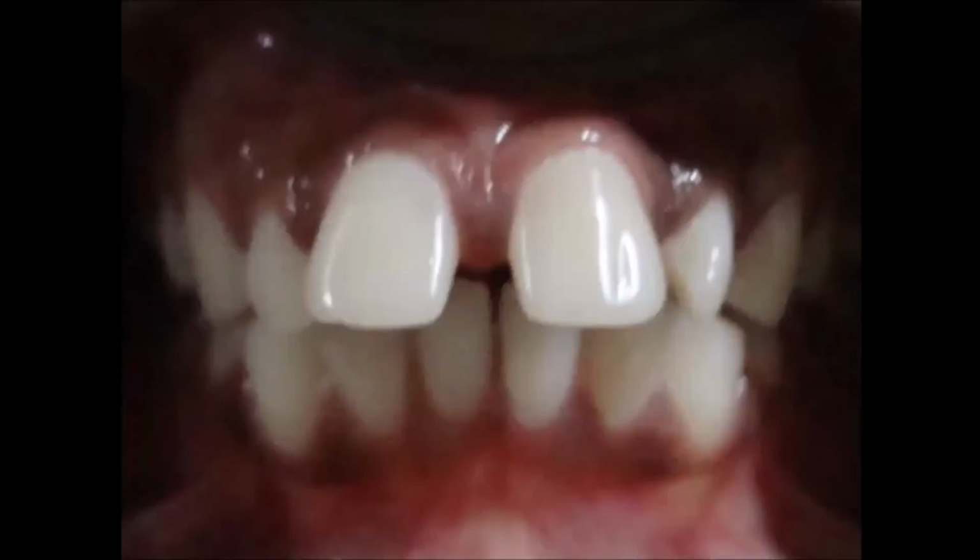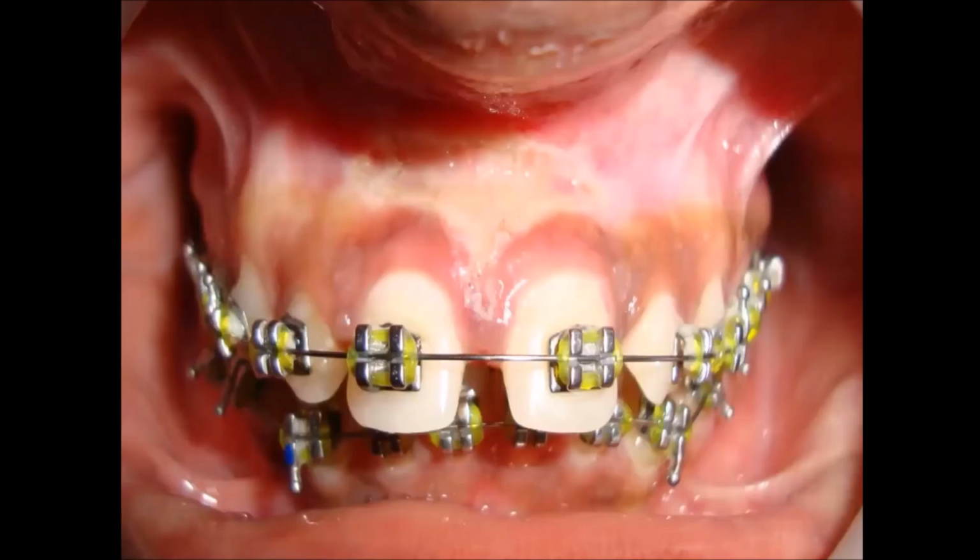So I'm going to show you a last case before I come out and take your questions. So here you can see this patient had come for an orthodontic treatment. She had spaces. We did a procedure called frenectomy.